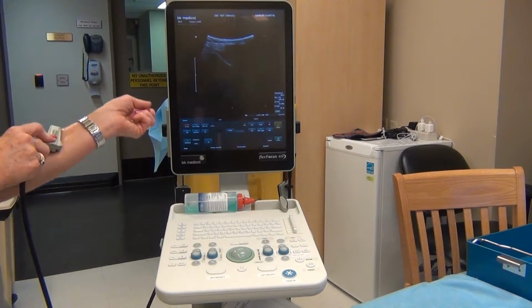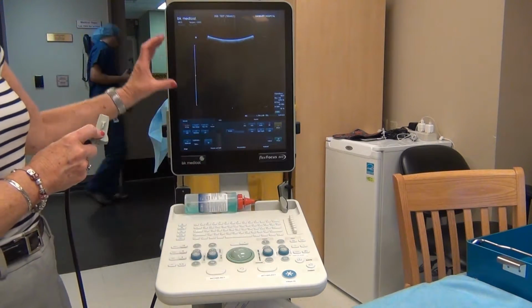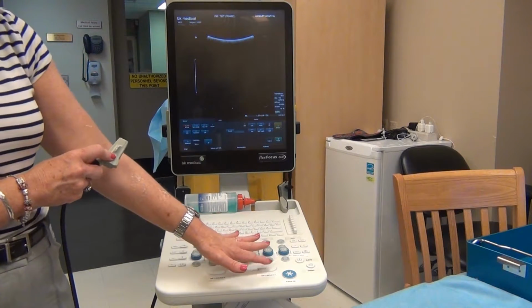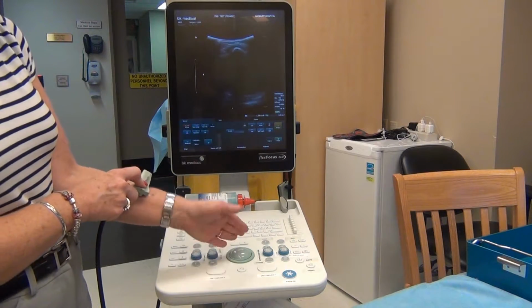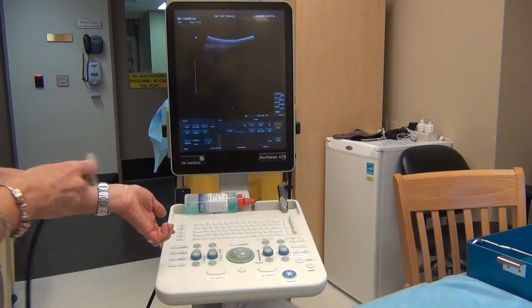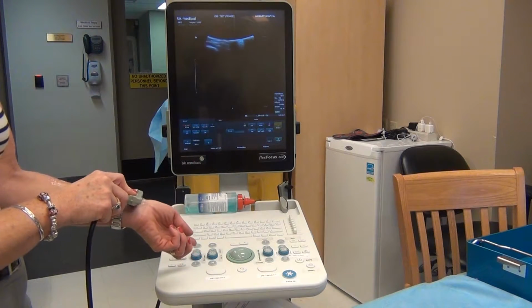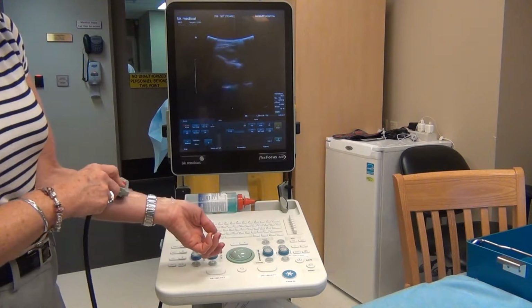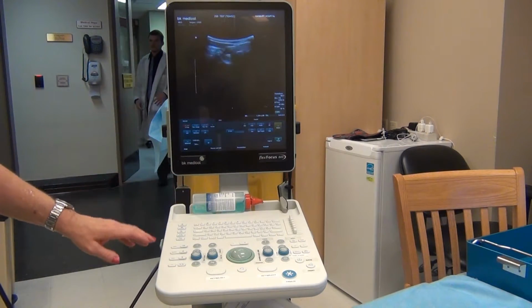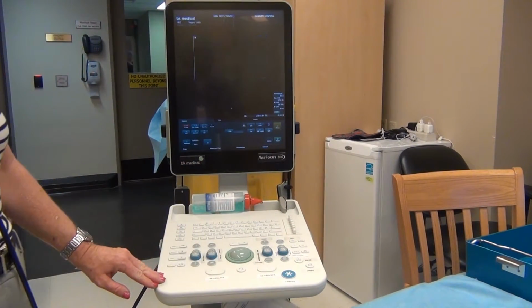I can also adjust the size of the focal zone by hitting the plus. I can have it really big, or I can hit the minus to make it small. And then I'm just going to hit it so it sets again. So we're looking at something, and let me get to a vessel here. Now I'm going to demonstrate your Doppler. Actually, it's just easier if I do it on my neck. Okay, so I'm going to take a look at my carotid here. Just going to adjust the depth.